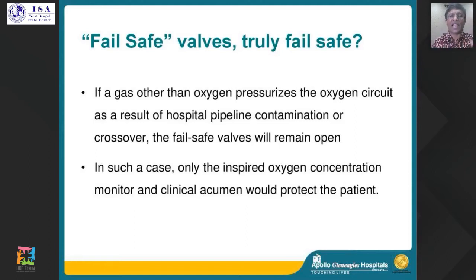The fail-safe valve, the fail sensors are all about pressures. In such a case, you cannot guarantee that the other gases like nitrous will go down, because the pressures are remaining constant.